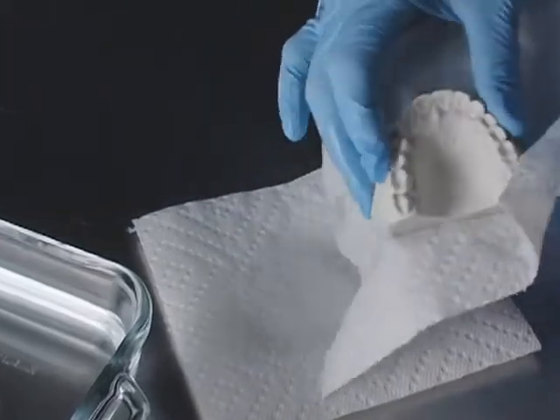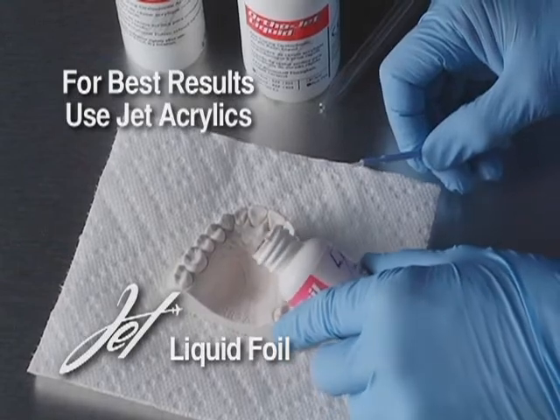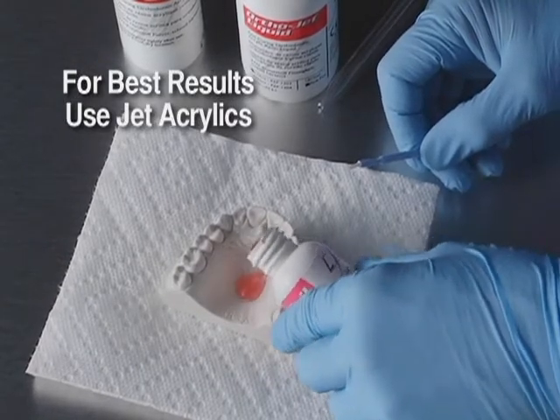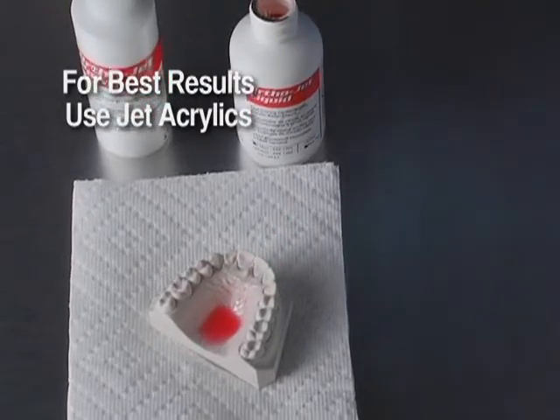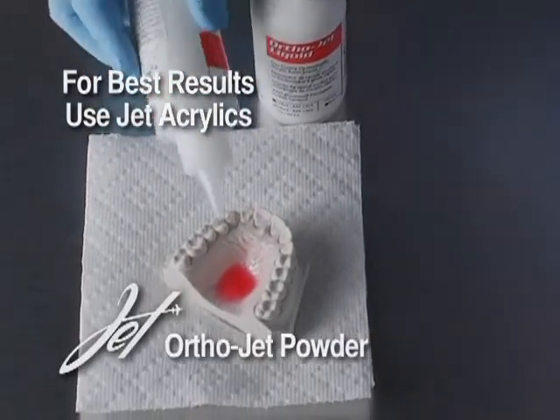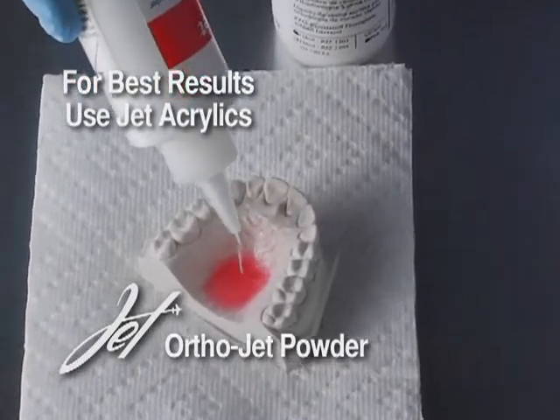Now surface dry the model. Apply an appropriate coat of tin foil substitute. Fabricate the appliance using self-curing acrylic. Let it set to a dough so it doesn't flow, but put it in the AquaPress before the exotherm occurs.